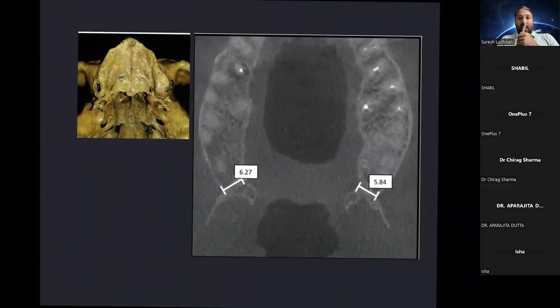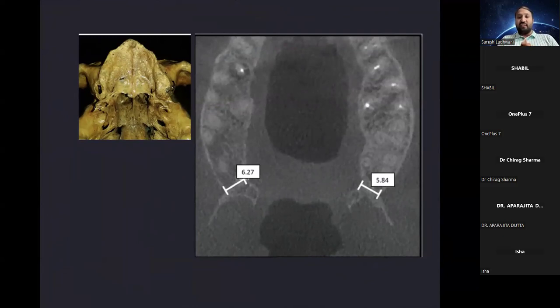Now, the first image you have seen, if I take a CBCT of this image, what I can see, the marked area is your junction area. This is just to make your mind correlate with it. We will deeply study this thing, but just to make you start correlating with natural clinical anatomy and radio anatomy. The junction is what I have marked over here.